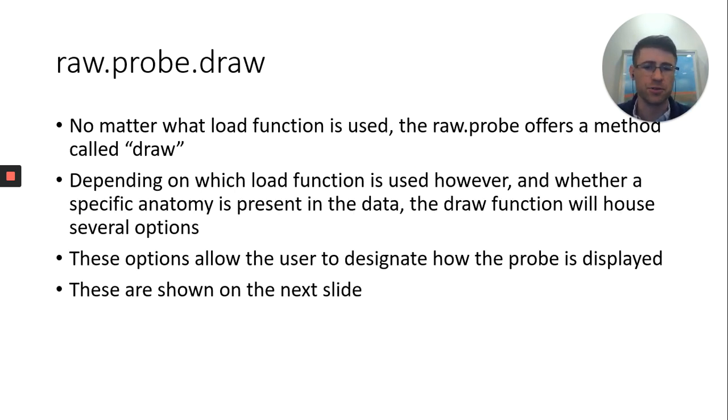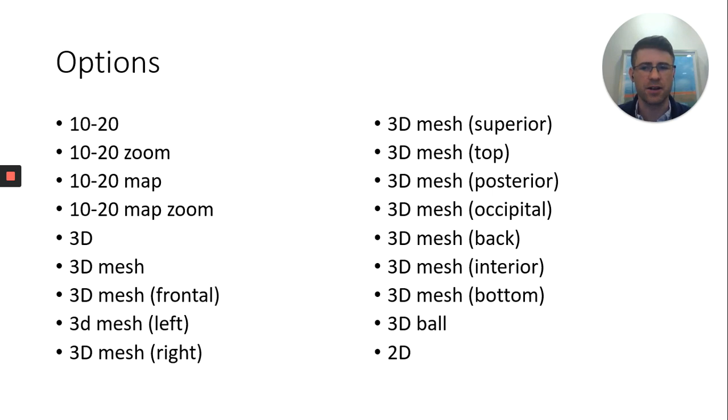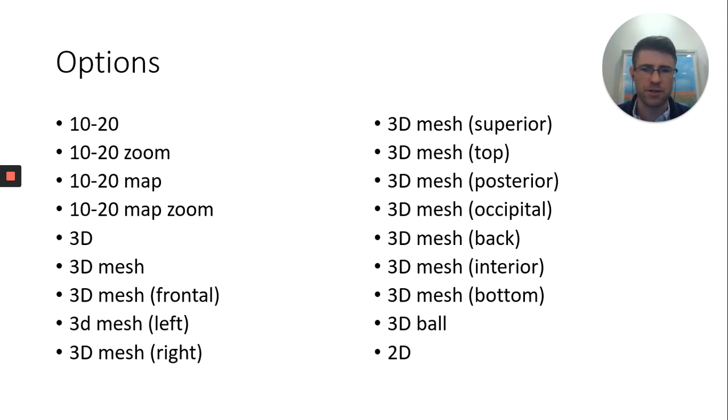No matter which function you use, you will have a function called draw, which means if you say raw.probe.draw, it will actually do something. Depending on which function is used and whether or not specific anatomy is present, you'll have different options. These options are as follows. And I won't go through, we would like to show each one of these, but I won't read them off for you. But of course, you can pause it and go through this if you like. So these are each of the options you have as far as the draw function goes.